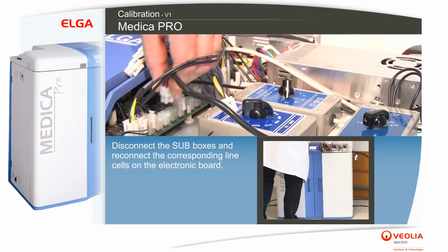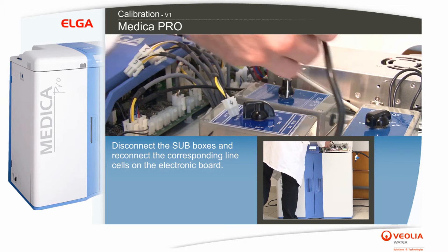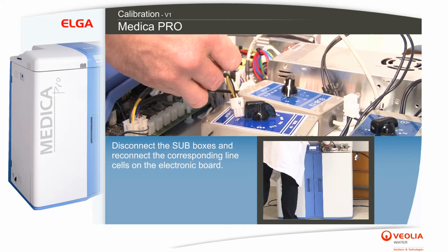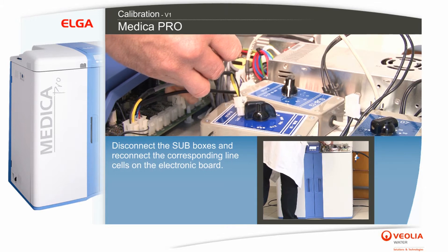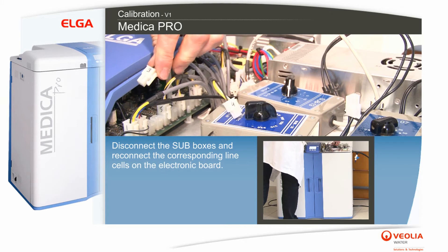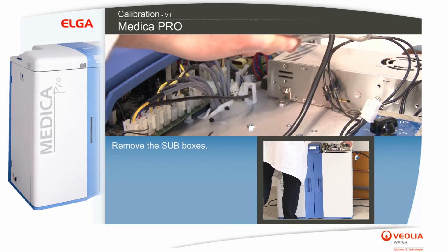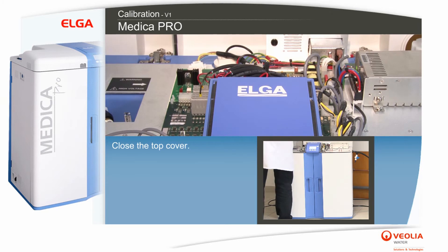Disconnect the sub-boxes and reconnect the corresponding line cells on the electronic board. Remove the sub-boxes. Close the top cover.